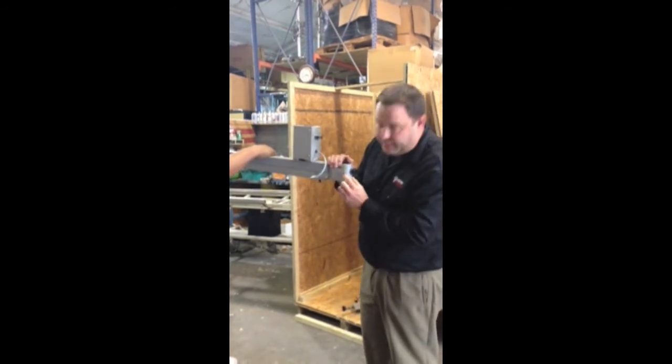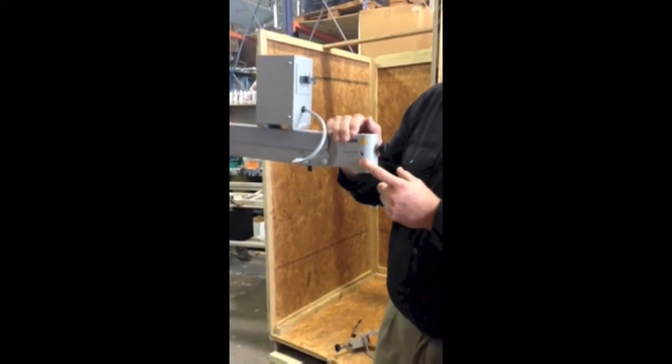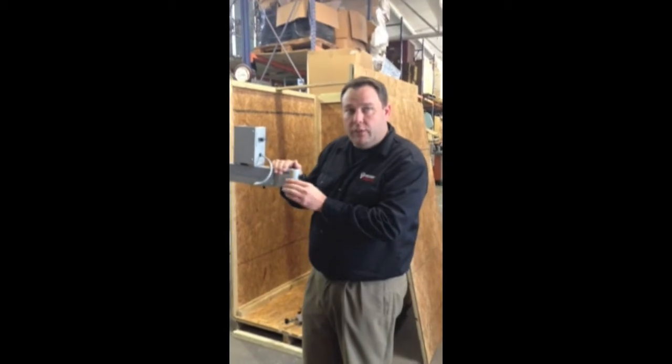Right here you're going to have a set screw as well. Now this is already going to be loosened off, but you're going to need to know where that set screw is later because it helps secure the head to this arm.